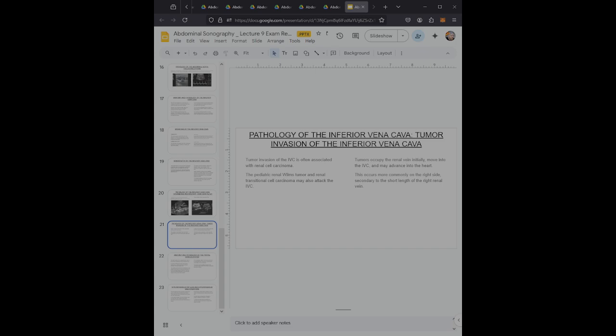Sonographically, the hepatic section of the IVC can be recognized as an anechoic tube in the sagittal plane, marking the posterior border of the caudate lobe of the liver. In the transverse plane, the pre-renal and renal IVC will be oval in shape and can be seen to the right of the abdominal aorta. The size of the IVC is variable, although its diameter should never exceed 2.5 centimeters.